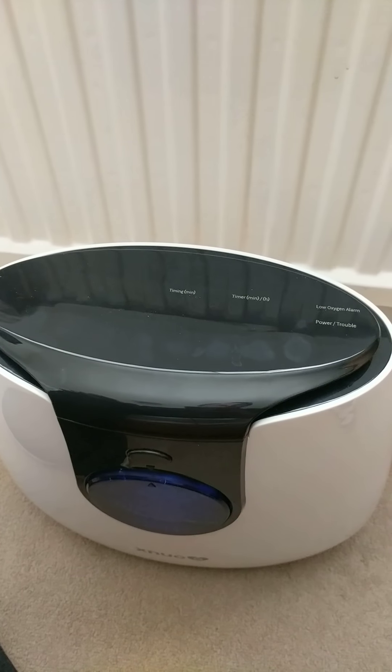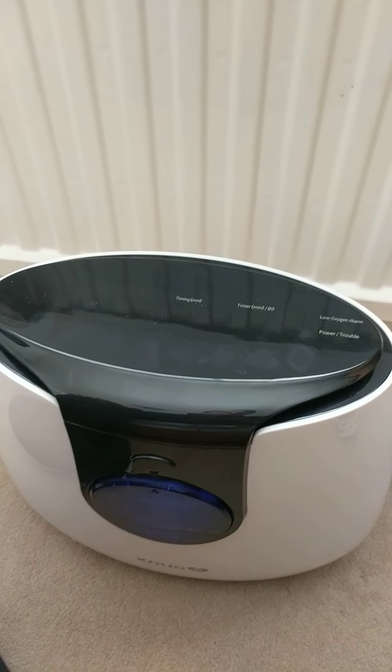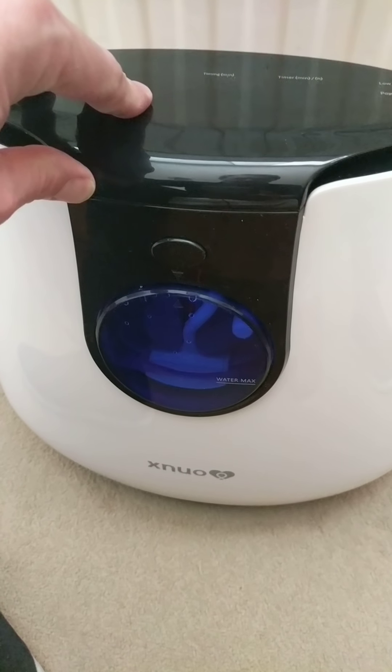This is a brief review of a XNUO Y4. Here is the unit itself.